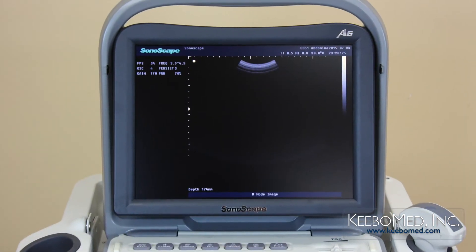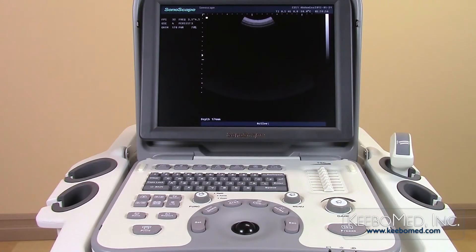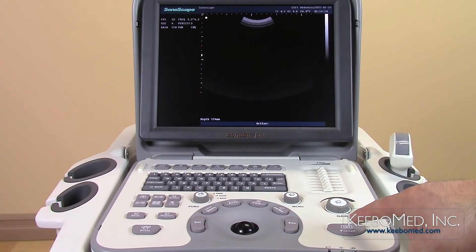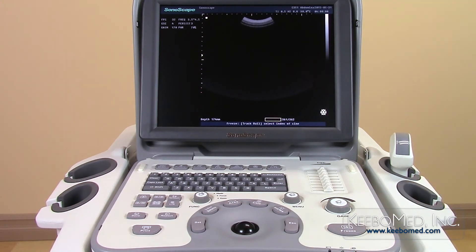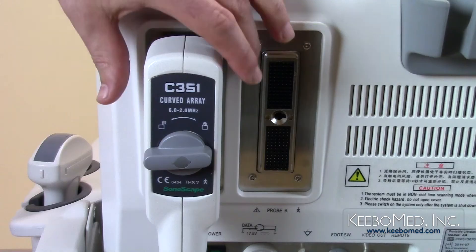Probes can also be connected or disconnected from the ultrasound while in exam mode. Freeze the image first using the freeze key on the keyboard. Now the probe can be safely connected or disconnected.